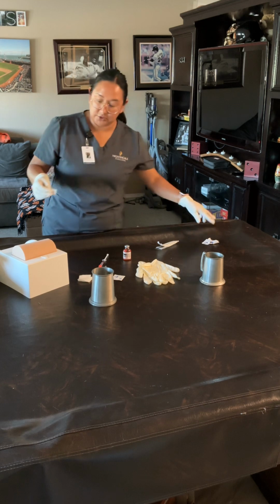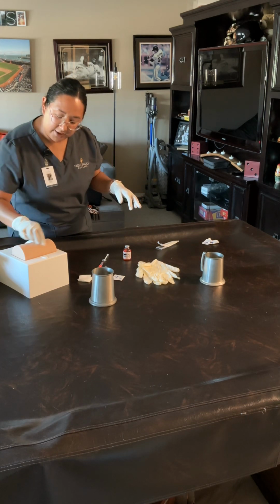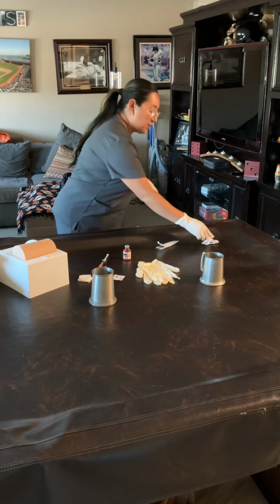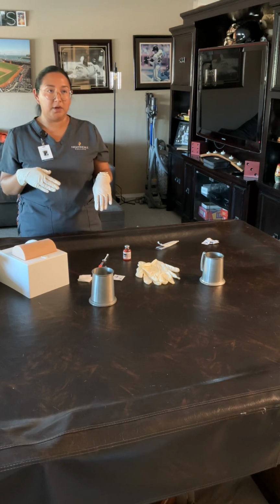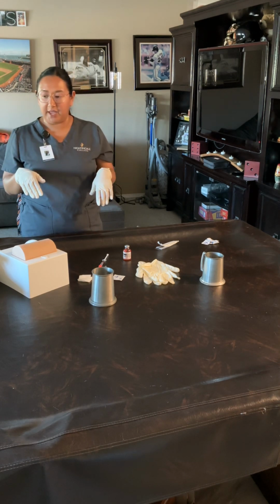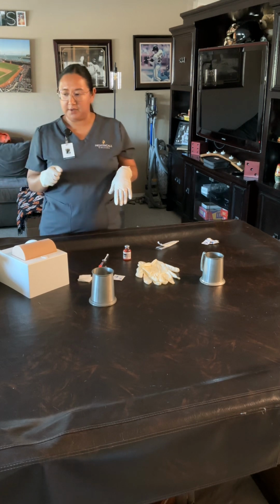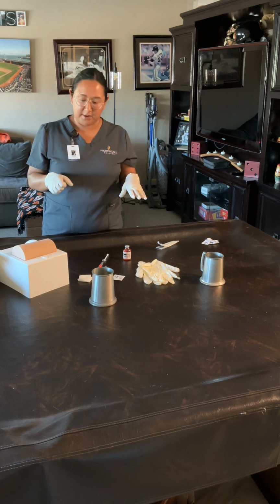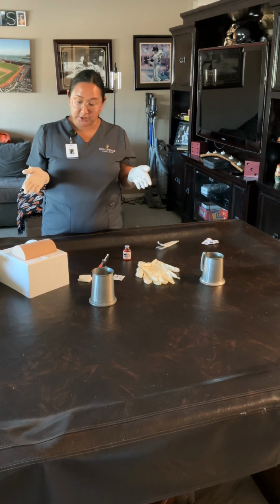So I'll make sure it's clean. I'll wipe about 5 inches around. Great. Let that air dry. Do not blow on it or use your hands to do all that. Okay. So now that the skin's all prepared, I can prepare the injection.